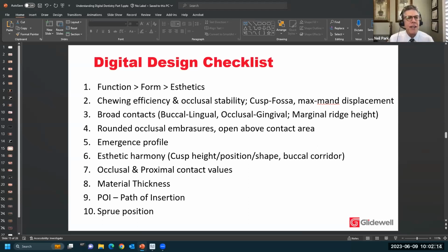Thank you, Justin. This whole idea of making a crown underneath an existing partial without taking the partial away from the patient, to me, that is such a valuable tool and such a great reason to have these kinds of capabilities in your practice. So thanks for showing that to us.